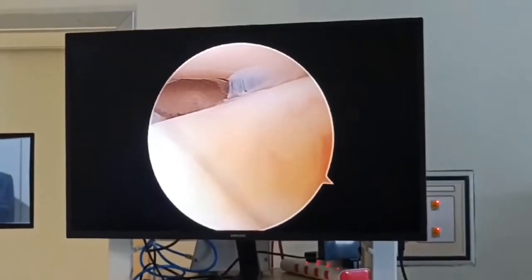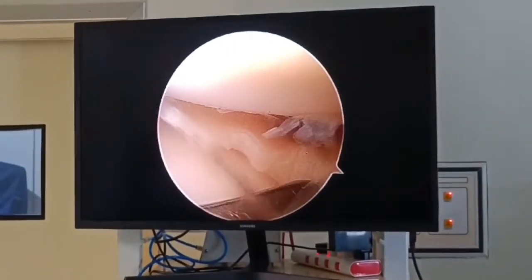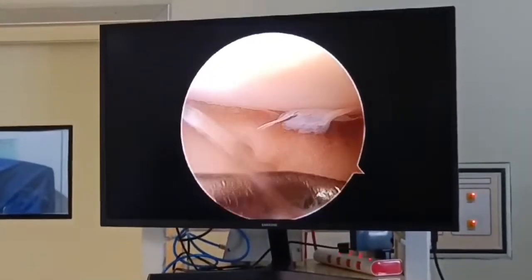The completed repair can then be checked with the probe. As you can see, I am palpating and the rent is closed, and the meniscus has also been given a good, nice shape.